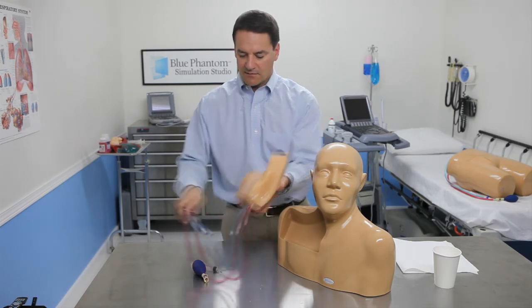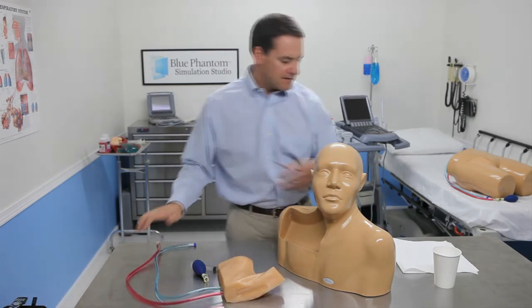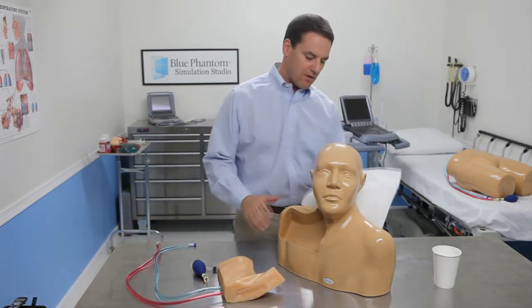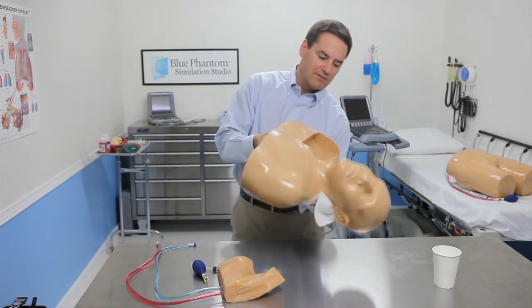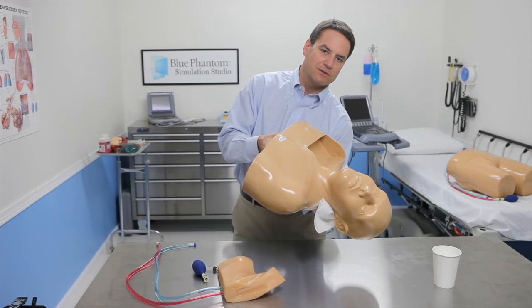Once that's done, go ahead and set it aside and take your paper towel, place it in the back of where the tubes come out, and then you'll pour out the extra fluid that you infused in there.